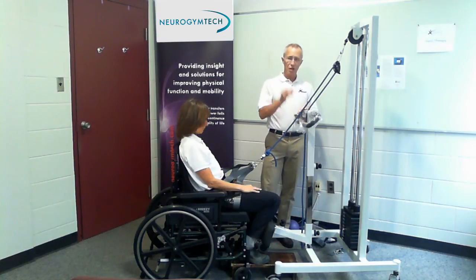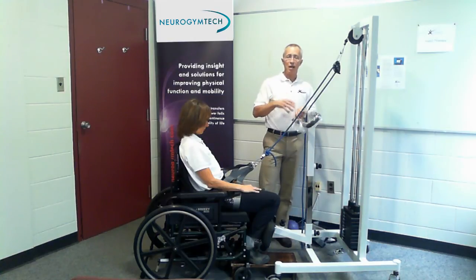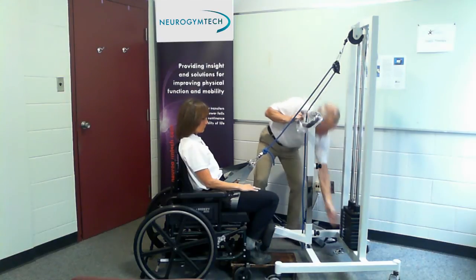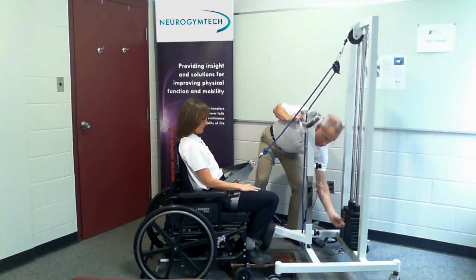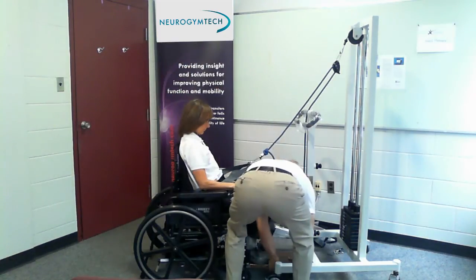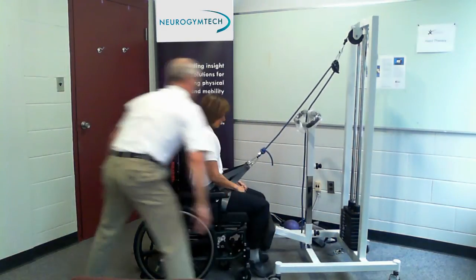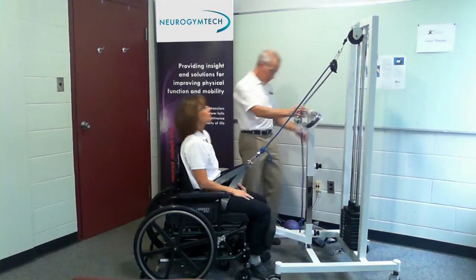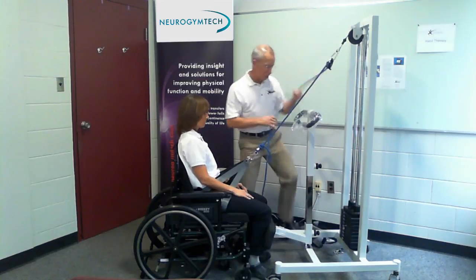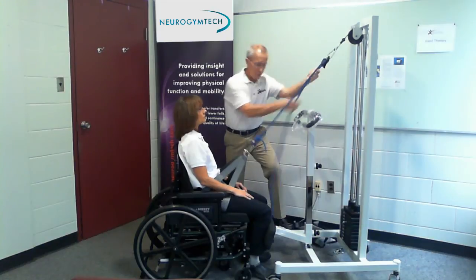Moving to application number three — that's for a plopper. This patient ambulates around the facility okay, but they just have trouble with those last 15 degrees. I'm going to select 30 pounds for this — you'll see why in a minute.